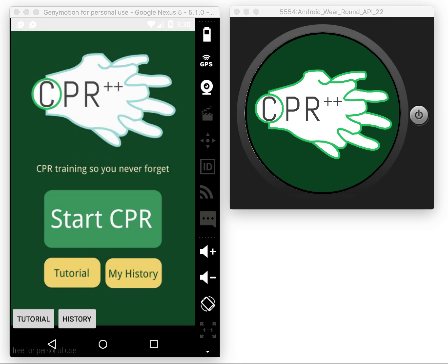This is a demo for milestone 2 of our CPR++ app. We are using a real button here to make it easier to move forward. The first functionality is to start CPR.